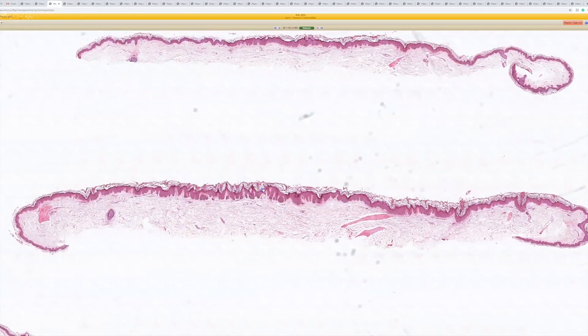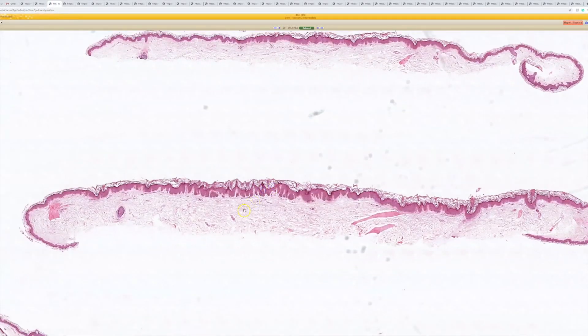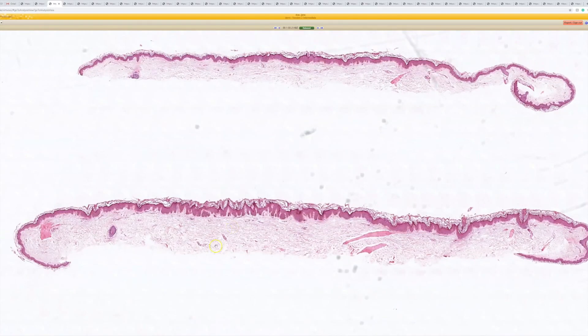On number two, what did you guys think this was? Just from this view I see hyperkeratosis and acanthosis — it's pretty thin and a little more plate-like, not super dramatic acanthosis. The diagnosis came a little more clear when we zoomed in to higher power.